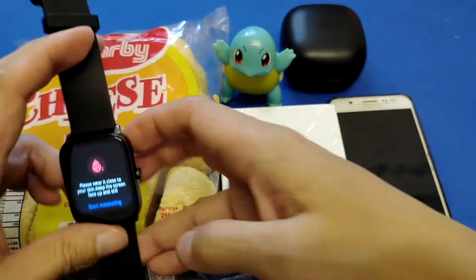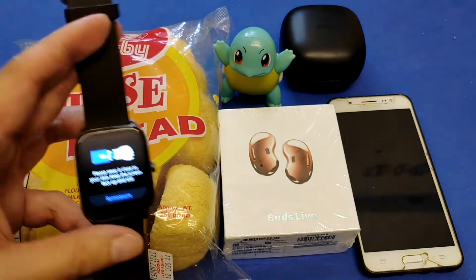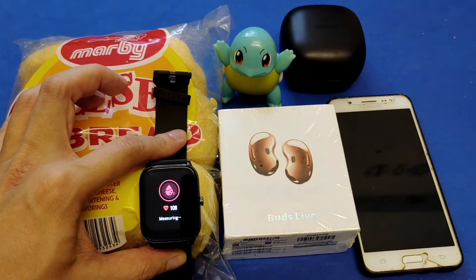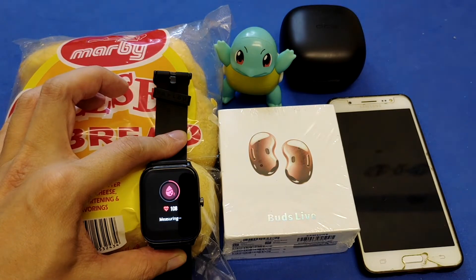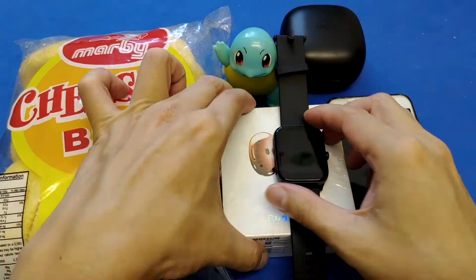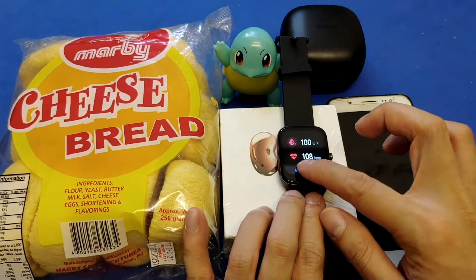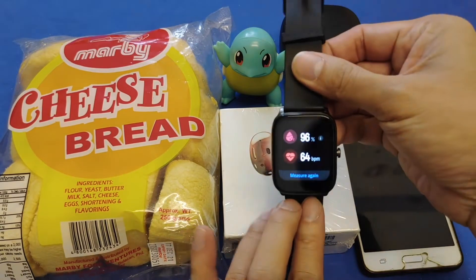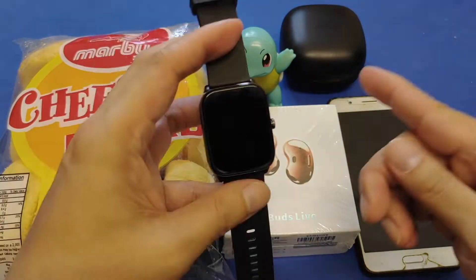I'm going to test five objects. Let's start with the bread here — I'll try to put the smartwatch on the bread and just wait a few minutes. The oxygen level reads 100. Second is the box of some earbuds — let's see if it is working. I'm going to place it on the printed surface of the earbuds box and it's also working.